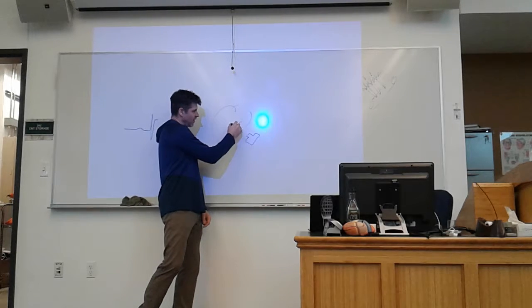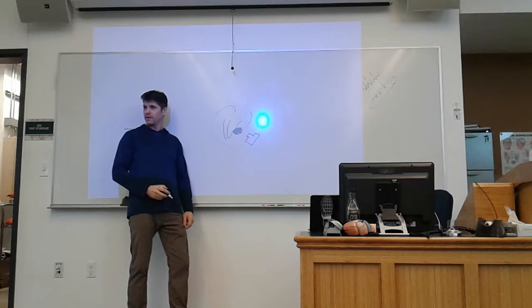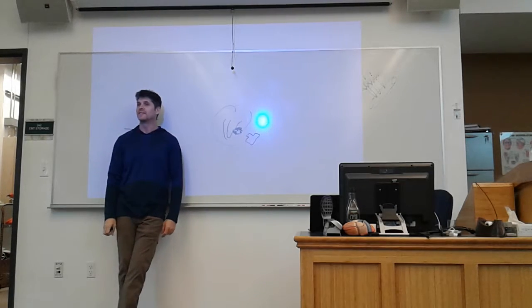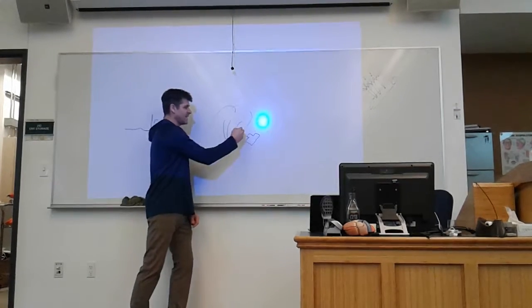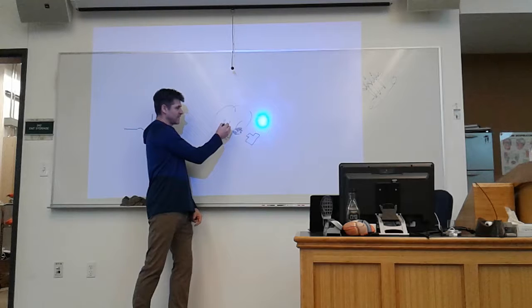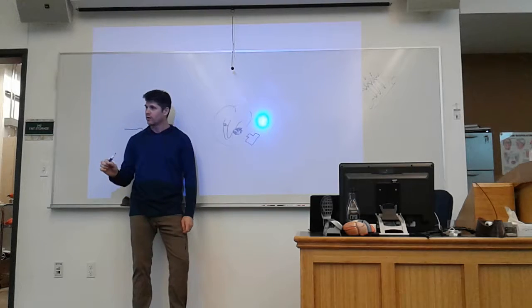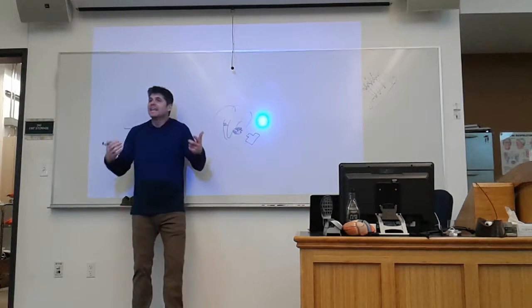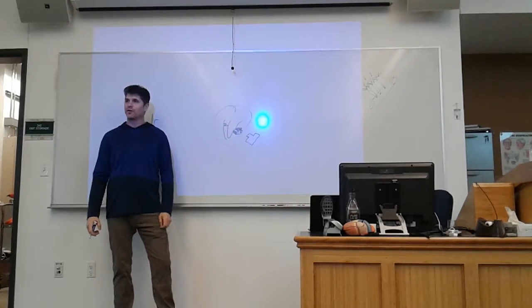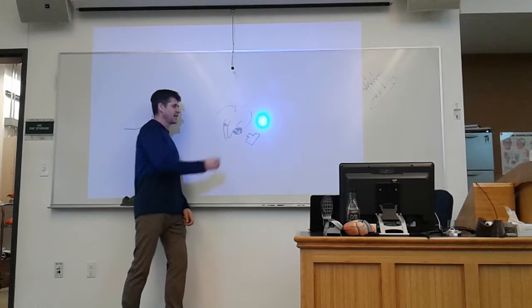If this is my heart tissue, like this, and this used to go that direction, all I can see is the septum, but it's dead now, so we can't see anything there. So that means this camera sees the next thing that it can, which is this, which is going that direction. This wasn't seen before because this area right here hid it from that camera. Does that make sense? But now it's not hidden from that camera anymore, so we get to see that activity instead of here.